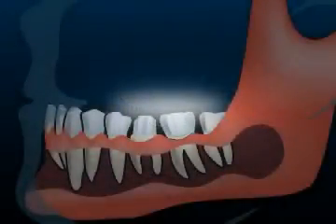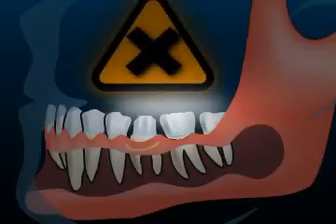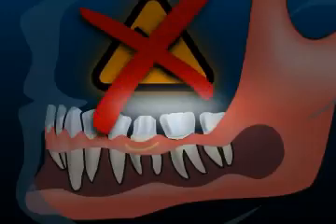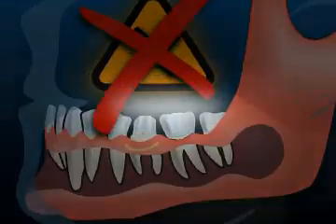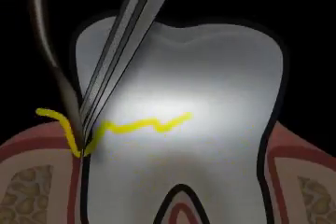But it's not only a precise abrasion that makes for a good dental crown. A lot of other steps are necessary in between in order to obtain optimal results. For example, before the impression is done, 2 ligatures should be placed, one of which should be removed just before the impression. In fact, various pastes do exist which can replace the ligatures, but sometimes these chemicals react with the impression medium and cause a distortion of the mold-making compound. The result is a crown that doesn't fit tightly.